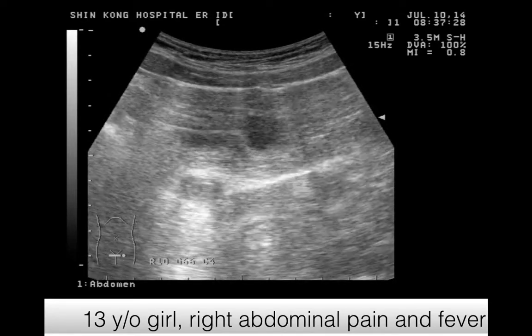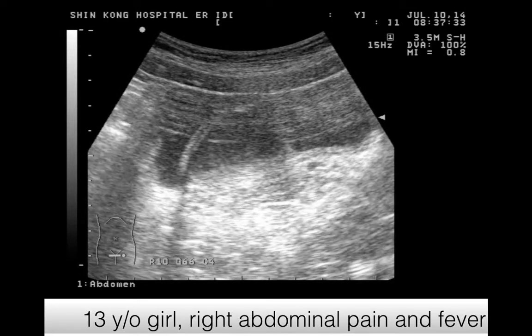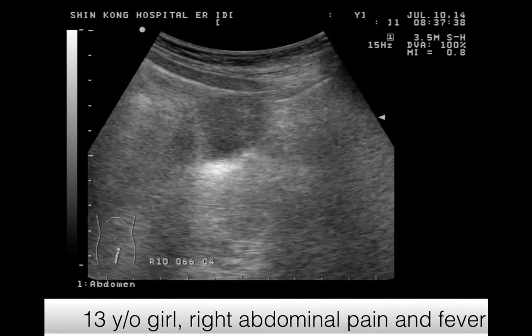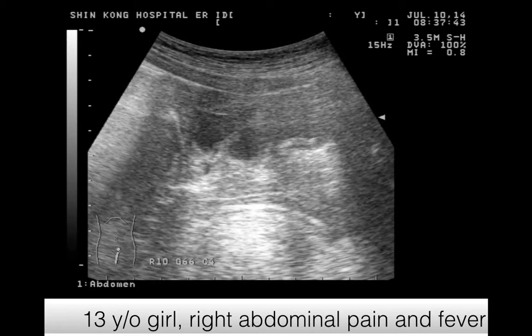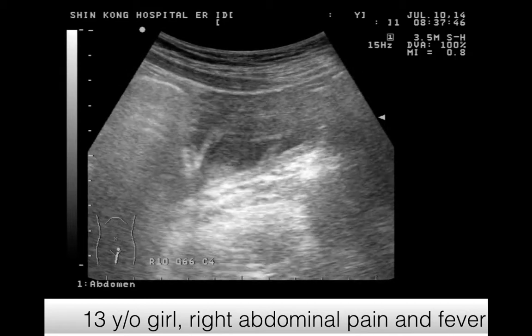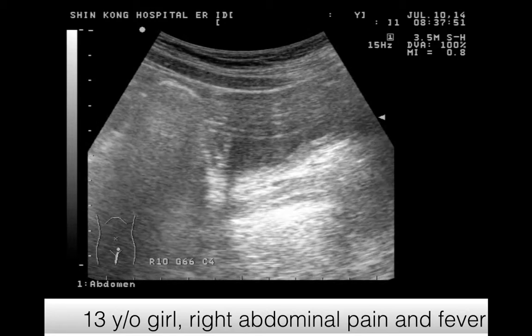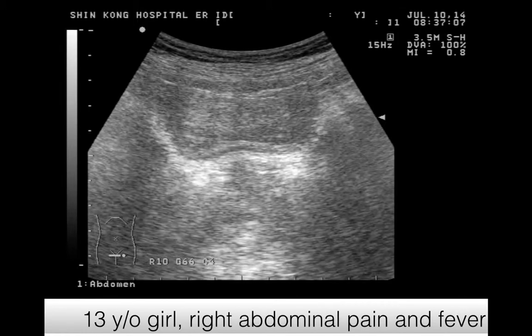Can you see here? An outpouching here. Some echogenic particles inside it got mobile movement. The longitudinal way, the bladder, and here, can you see the outpouching inside the bladder? What is this? Ureterocele. An outpouching of the ureter, protruding into the bladder.